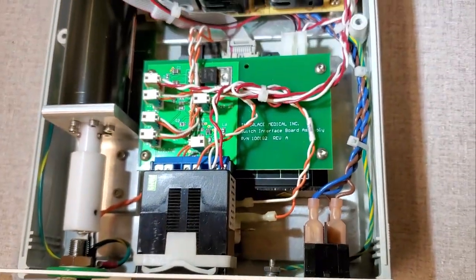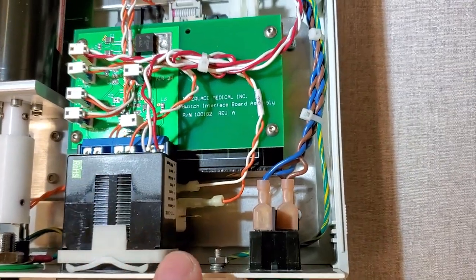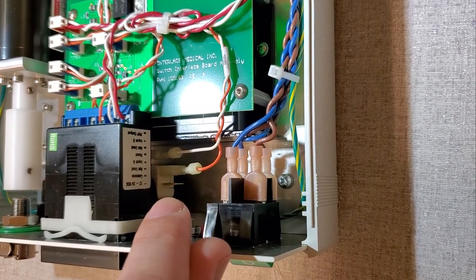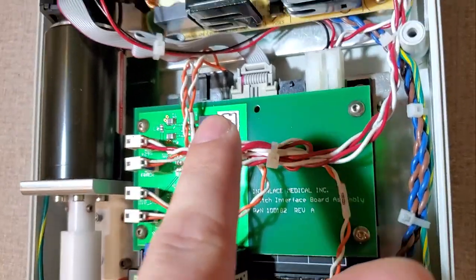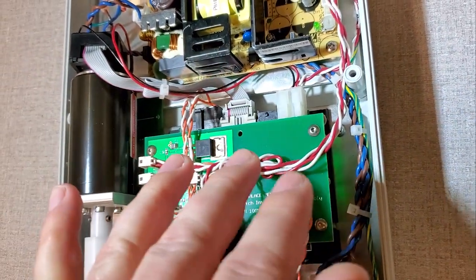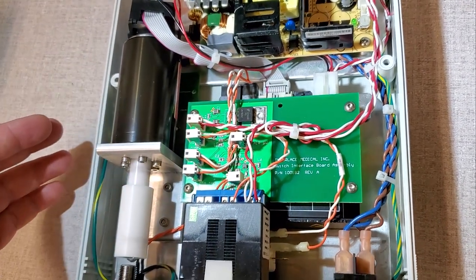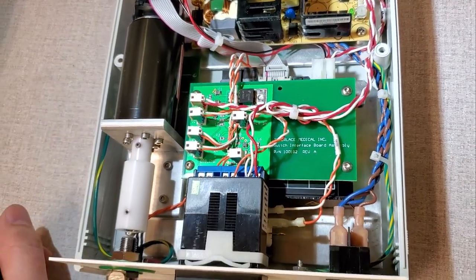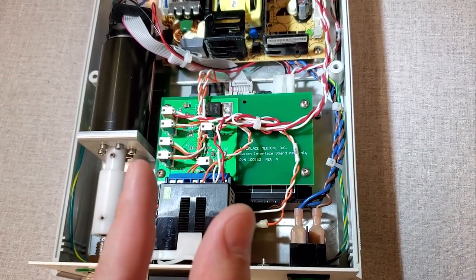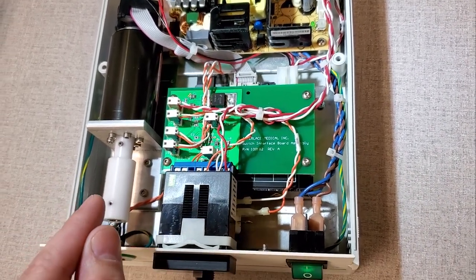That's an off-the-shelf part, and what they did is they adapted this little switching card right here, and right down there is an air pressure actuated switch, which comes up here and turns on this transistor right here, and it tells it to run a cycle. And a cycle is a designated amount of revolutions right there. So with a servo, you can control speed, you can control duration, which is the amount of time that it's running, and you can also detect errors.